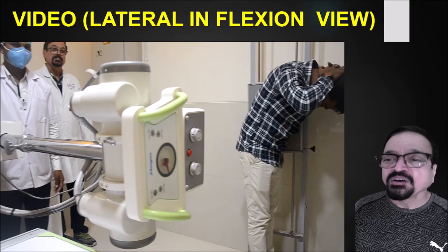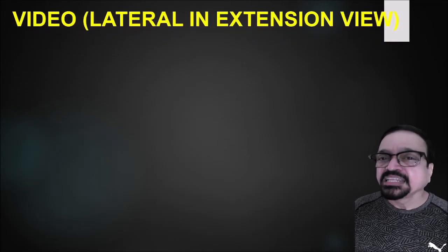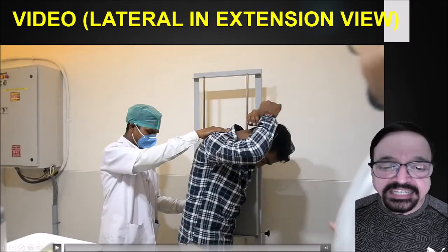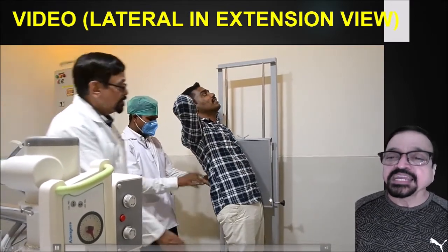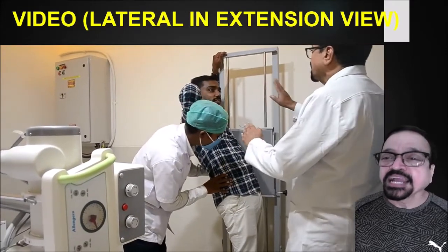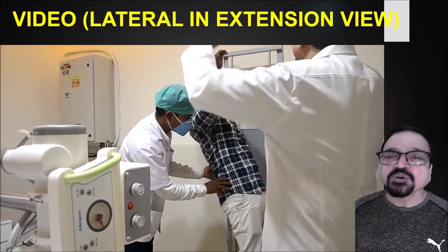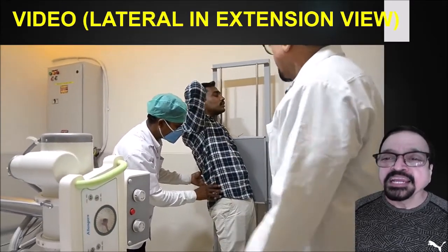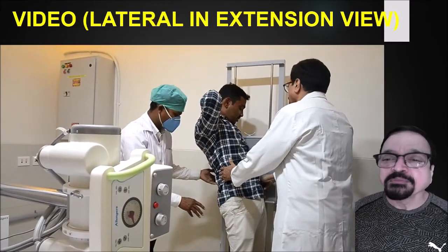So that is the technique of flexion. Extension will be similar. Now let us see a video demonstrating how an extension radiograph is taken. Here you have to take care that the patient will not fall down. For flexion it is easy, but for extension it is slightly difficult, because this patient has got pain, they have got a neurological deficit. It is easy to show how it is to be done, but sometimes it is difficult for a patient.